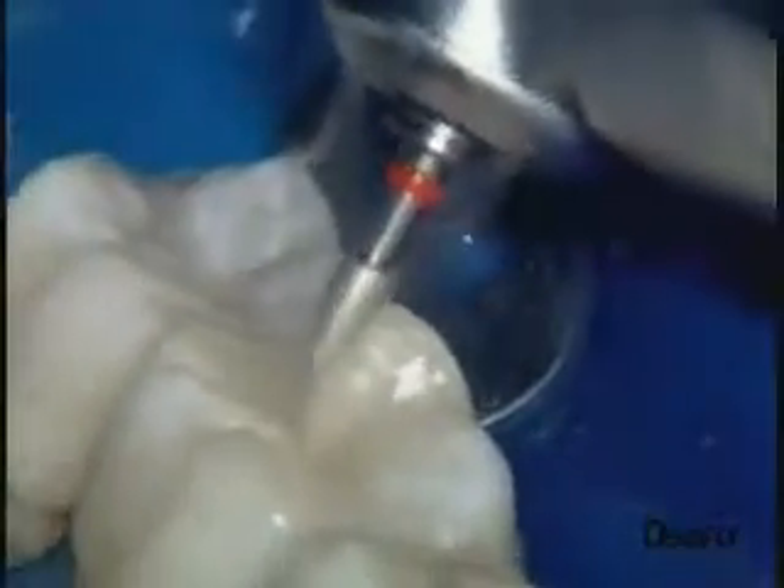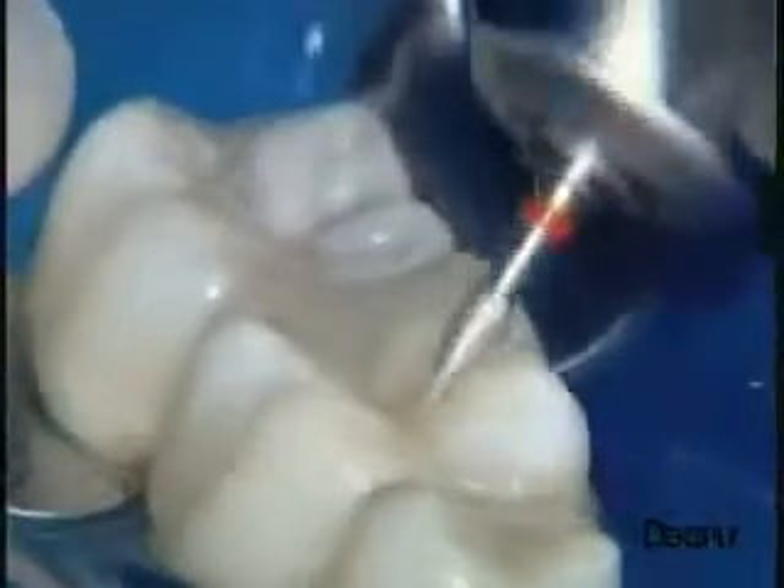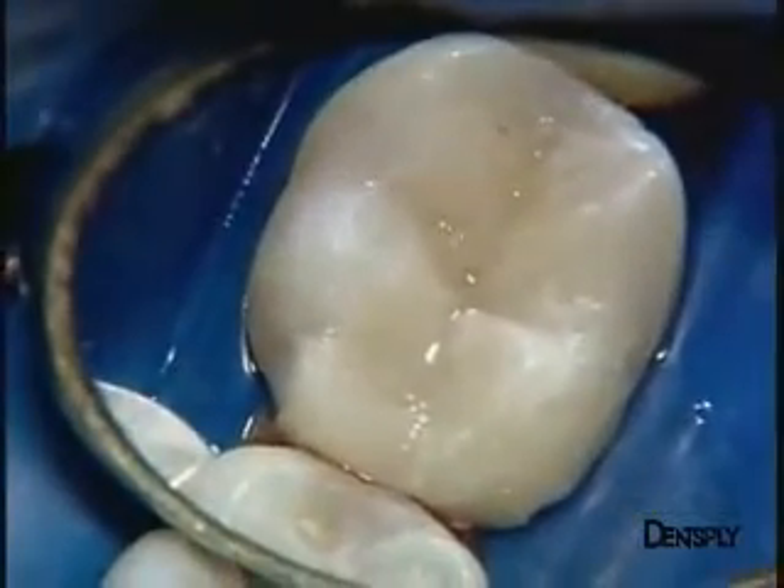This is particularly important when regulating the anatomical bite, as it will allow perfect positioning of the contact point adjustments in relation to the antagonistic tooth. We proceed little by little in small steps. Judicious use of the spray helps distinguish the composite from the natural tooth tissues, so that we preserve the tissues of the natural tooth.